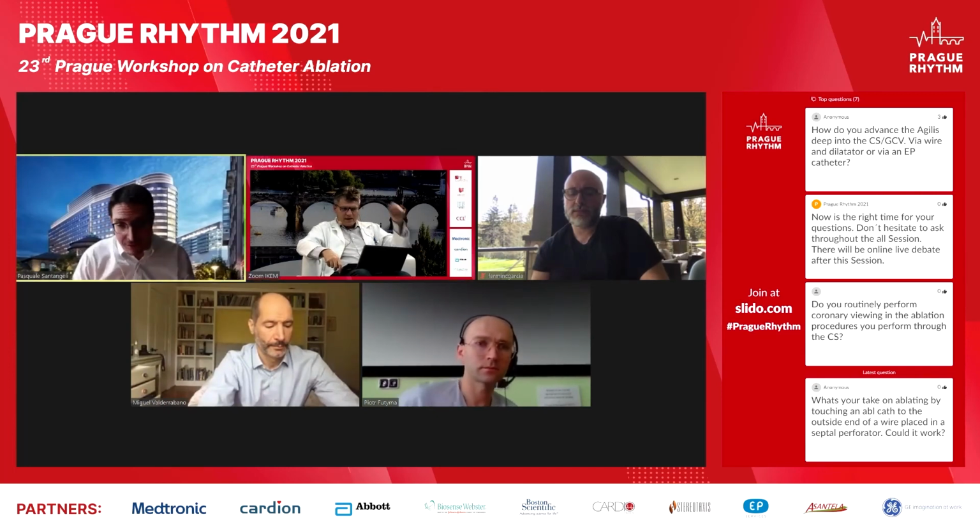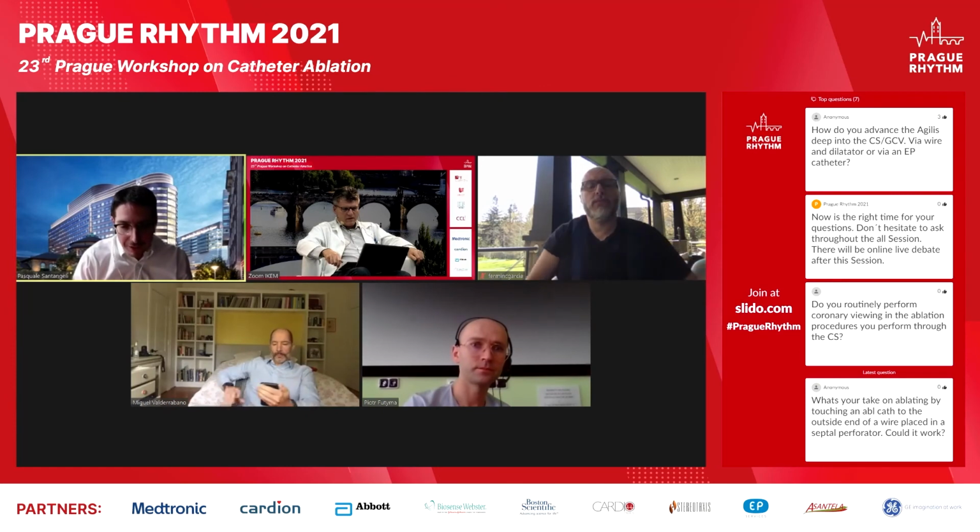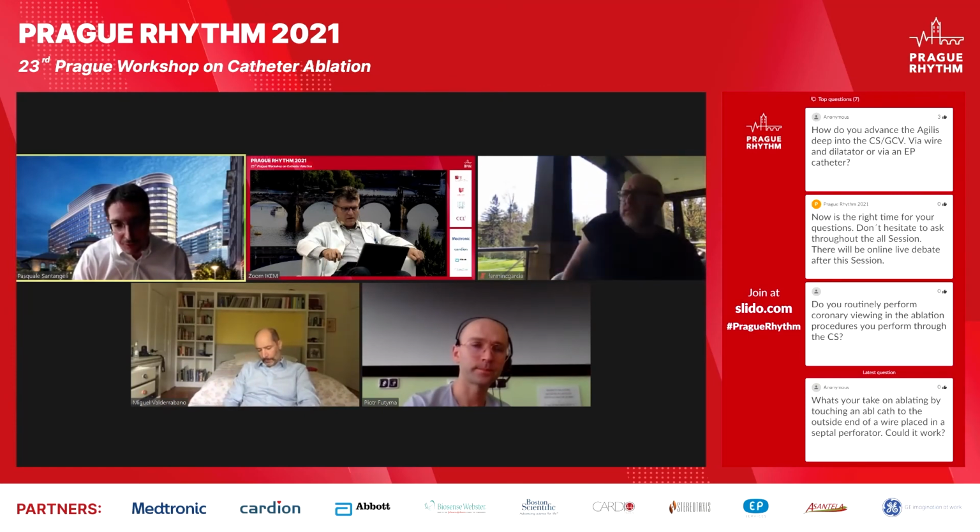That's a great question, Dan. Thank you, first of all, for the invite. I don't think we have data that shows the optimal cutoff for every single catheter. In fact, when we use those, we try to match the voltage cutoff in the individual patient to what we see with pre-procedural imaging or intraprocedurally with our eyes. Every patient and every catheter ends up with a slightly variable cutoff, because the 0.5 to 1.5 only applies to the ThermoCool platform, the 3.5 millimeter large tip. For the smaller electrodes, there is some data here and there, but the voltage changes so much depending on the type of electrogram, type of catheter, and wavefront of activation.